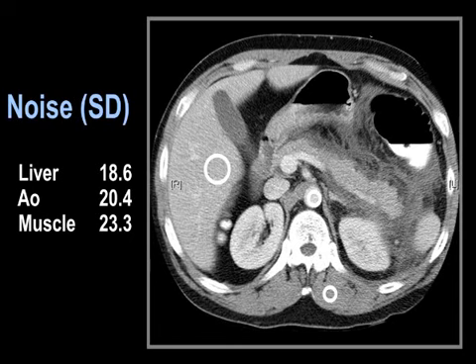that children are different than adults. I mean, you've heard that before, it's not just a small adult. And the other side of that is a lot of adults act like children, which is probably true. But from a scanning standpoint, we do need to treat children a little differently. And our observation was the following.